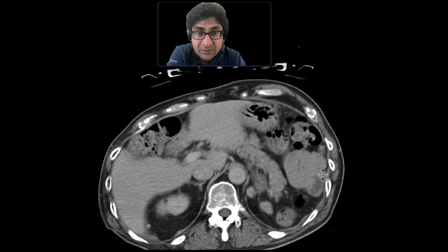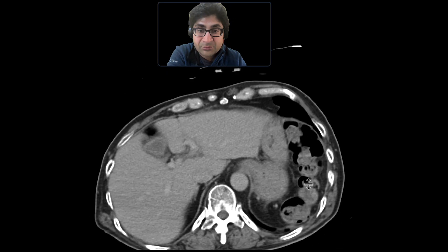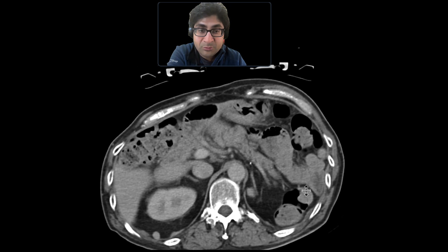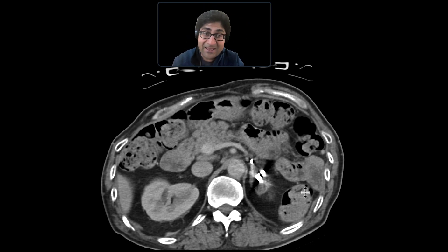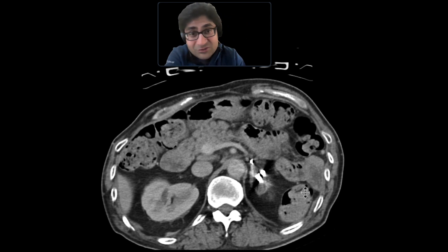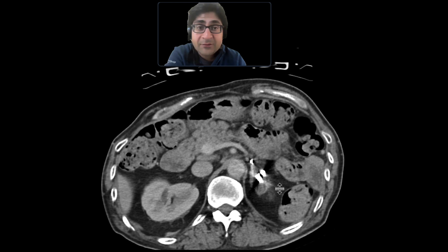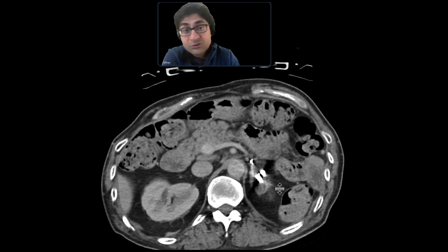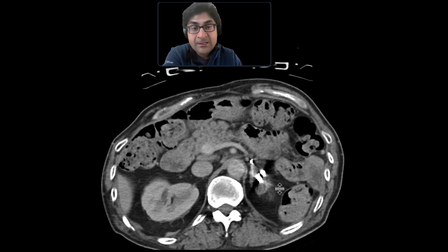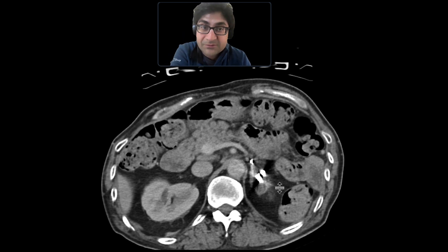This actually demonstrated quite long-term stability, and so all the findings were compatible with splenosis. You can confirm that with some nuclear medicine studies — liver spleen scans, heat-damaged red blood cell scans. You can also get an MRI, and if it demonstrates findings that you'd expect a normal spleen to show on T2-weighted images and post-contrast sequences, we can see reasonably confidently that it represents splenosis.